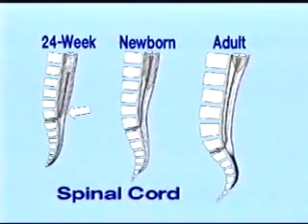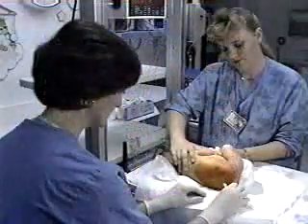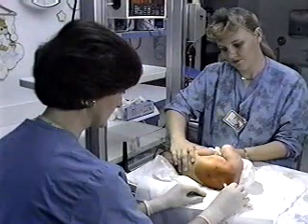To prevent trauma to the spinal cord, it's necessary to identify where the spinal cord ends and then to sample fluid from the subarachnoid space below the end of the spinal cord. The lumbar puncture procedure will first be demonstrated on a full-term neonate, followed by a preterm neonate.